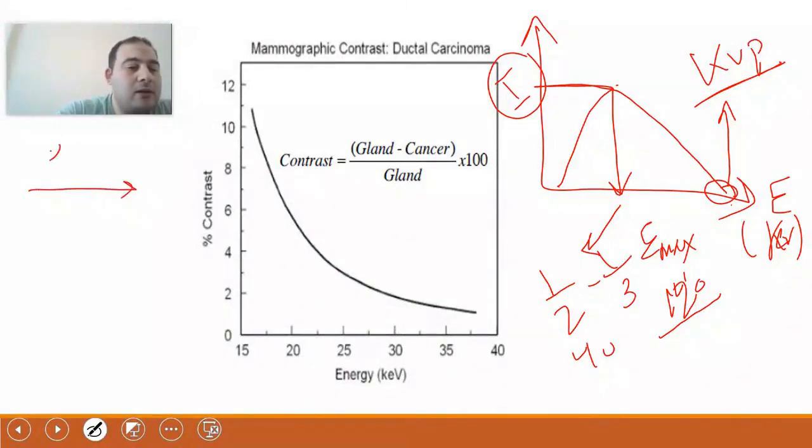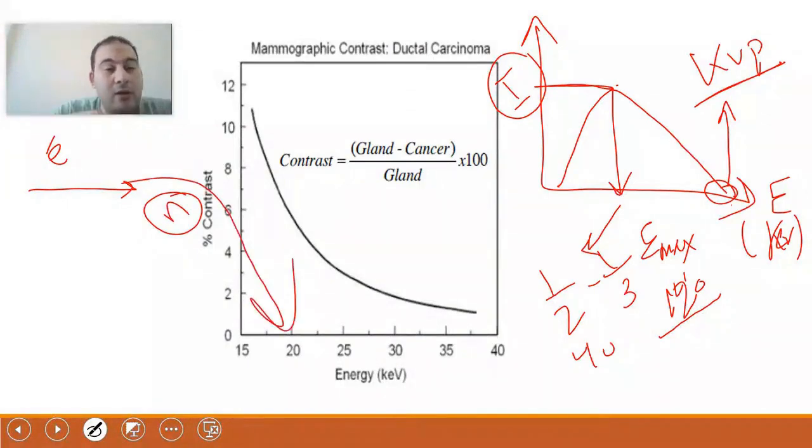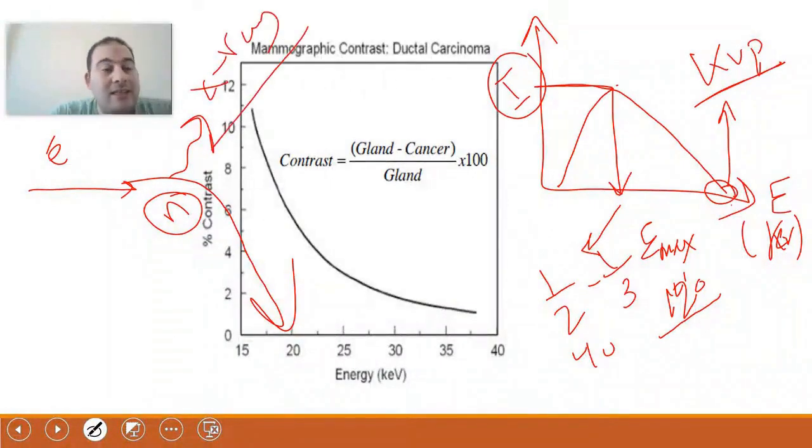Why does it occur? It arises from the interaction between an electron coming from the cathode and the electric field surrounding the nucleus. It experiences deflection, just like when you take a ball and hit it against a wall. What happens? The ball hits the wall and then falls to the ground. The ball lost part of its energy in the wall. Now, the part of the energy lost by the electron, being negatively charged and interacting with a very strong positive field, caused it to deviate from its path, resulting in energy loss known as X-ray, which is the braking radiation.